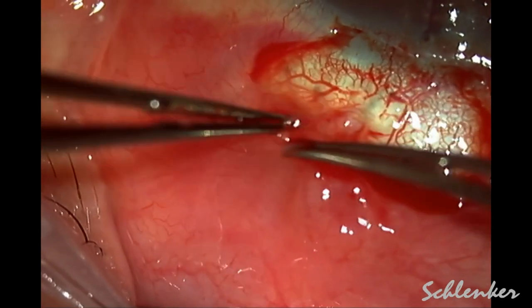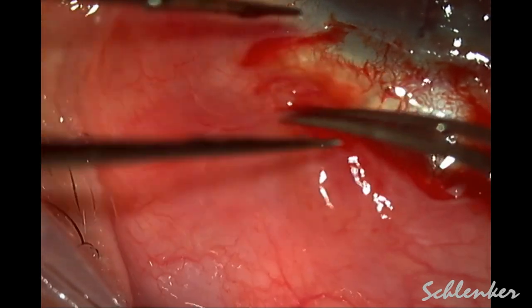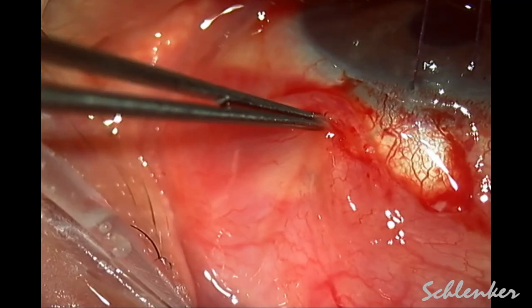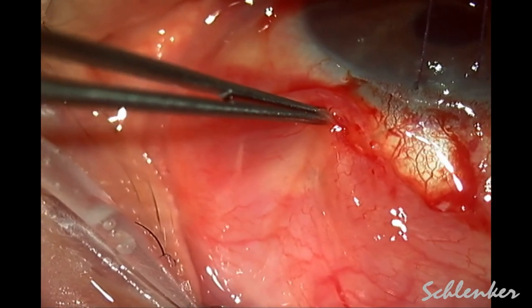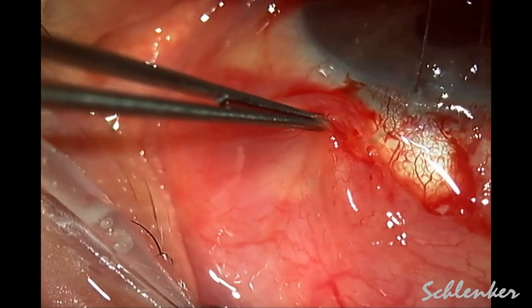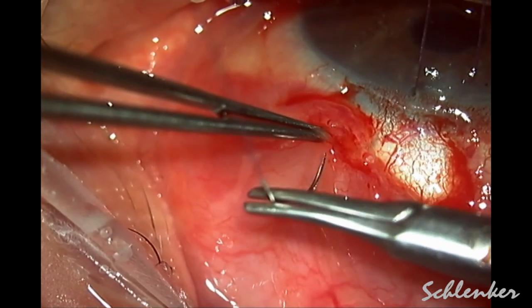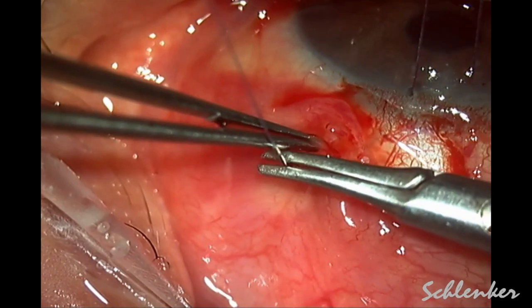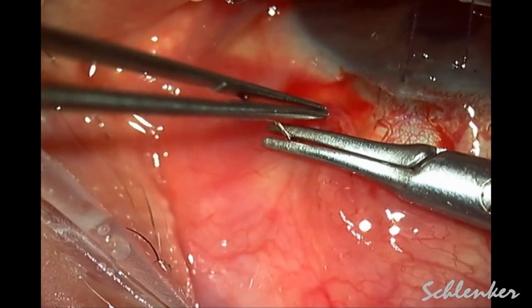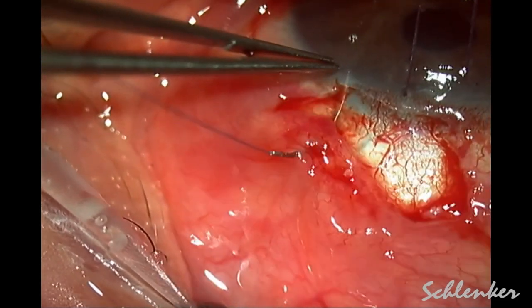Here we are looking at the closure — there was enough conjunctival tissue for a conjunctival pull-down all the way to the limbus — and then using 8-0 polysorb to close at the limbus.